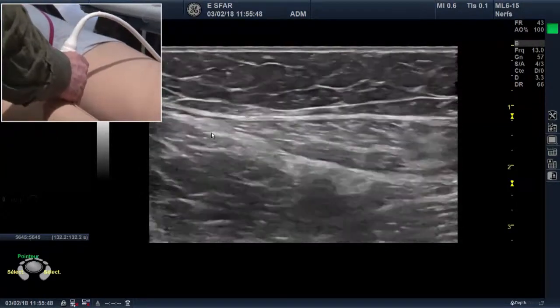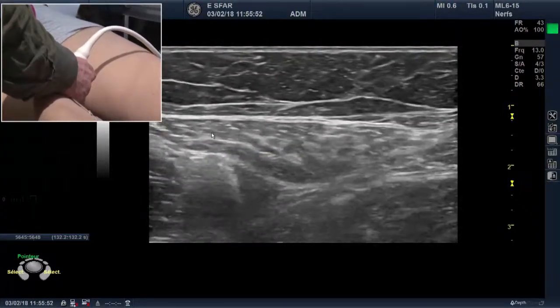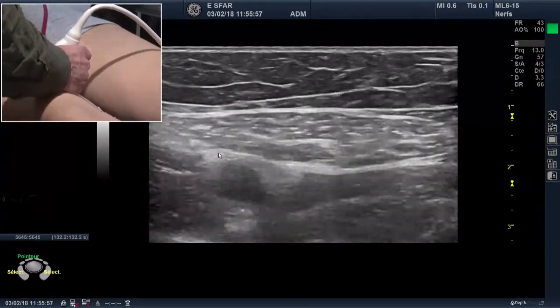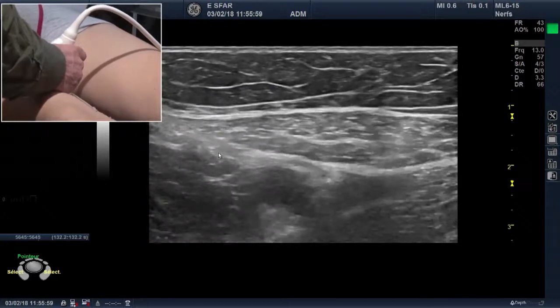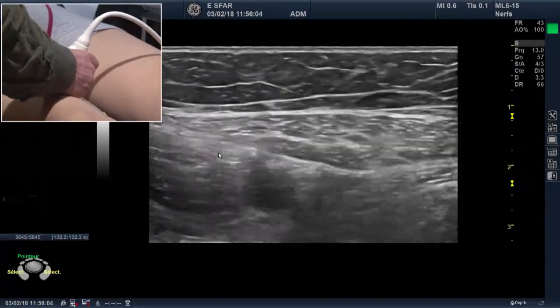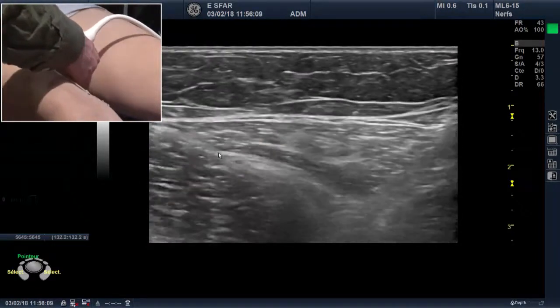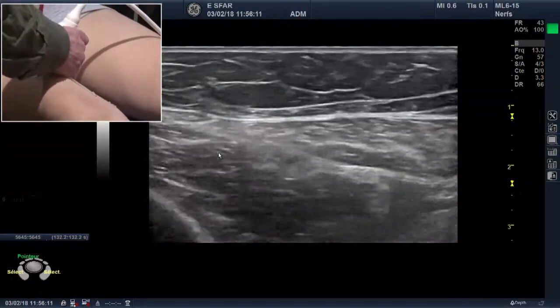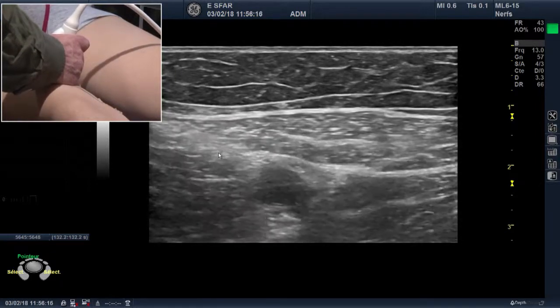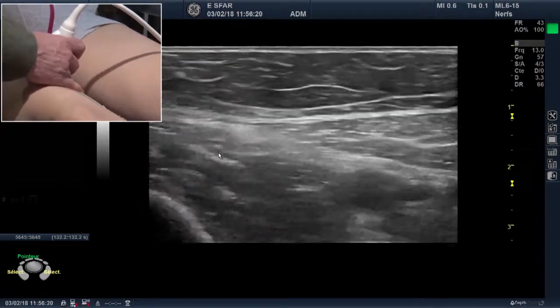At this level, you see that the femoral artery is going to dive. And because this membrane is so thick, because the compliance of this area is so low, the local anesthetic has no other solution to escape and to go downside in the popliteal area. And this explains most probably most of the effect of the distal approach. That's all.